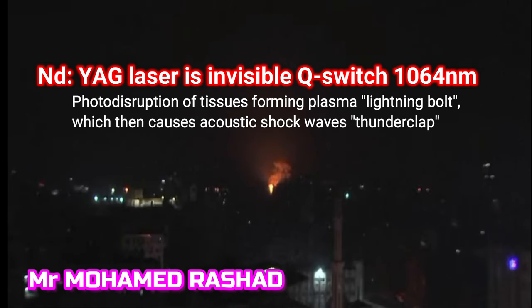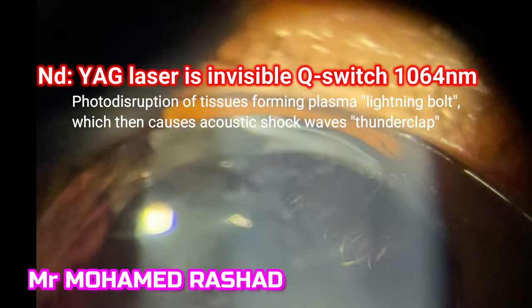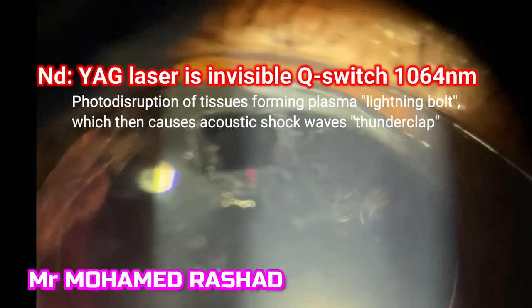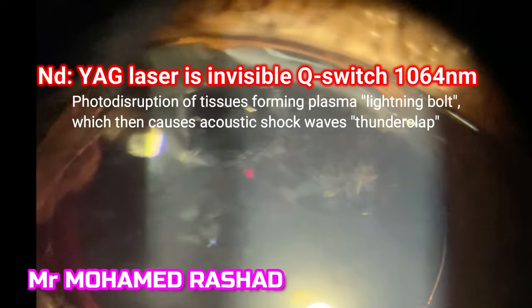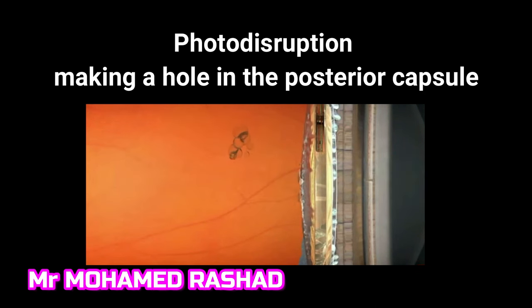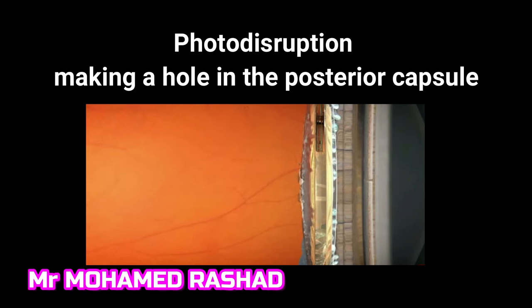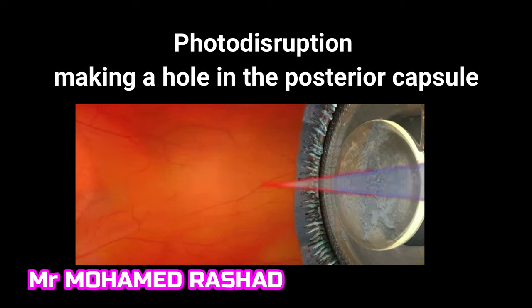You can see here the photo disruption doing a hole in the capsule. You can see the plasma with the air bubbles, and this is how the photo disruption and plasma formation make an acoustic shock wave that opens a hole in the posterior capsule.